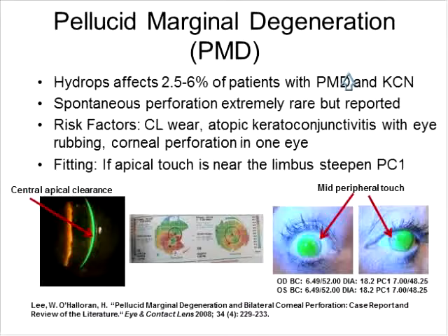Actually, Melissa, sorry to interrupt. One fitting technique that's very helpful is fitting a generous vault on an ectatic patient, in particular pellucid, or a young keratoconus patient who's showing rapid advancing. In the case that they're not going to have corneal cross-linking, you want to give them a little more room to grow, essentially, because otherwise they're going to be contacting the back surface.